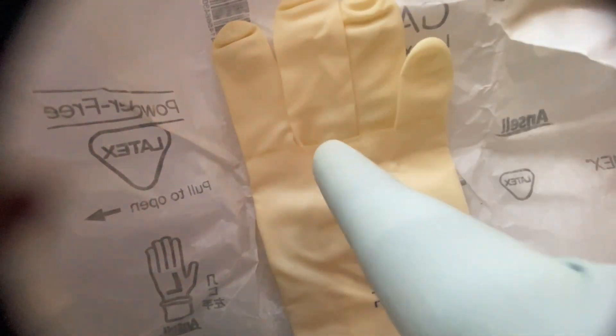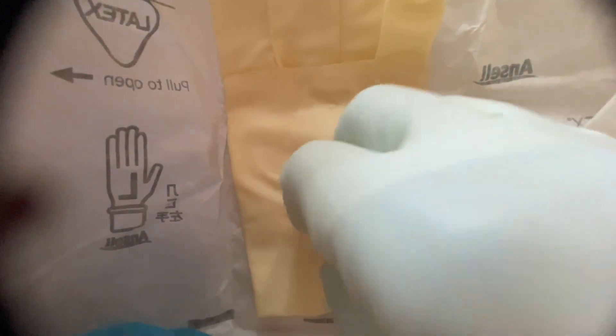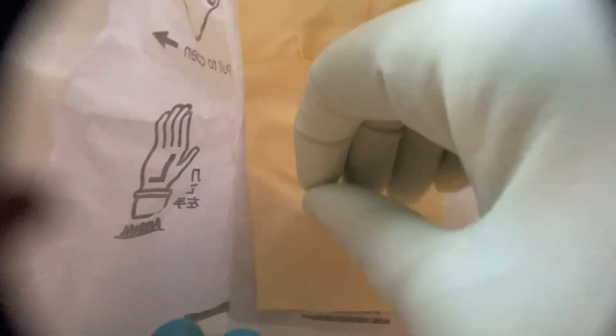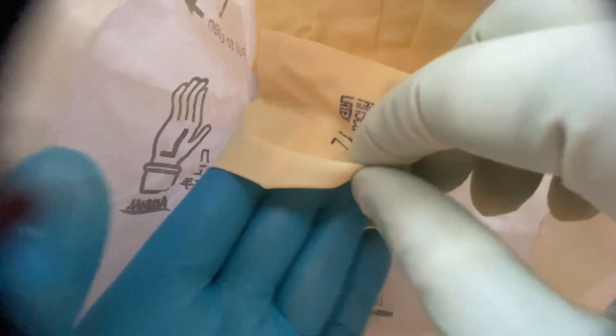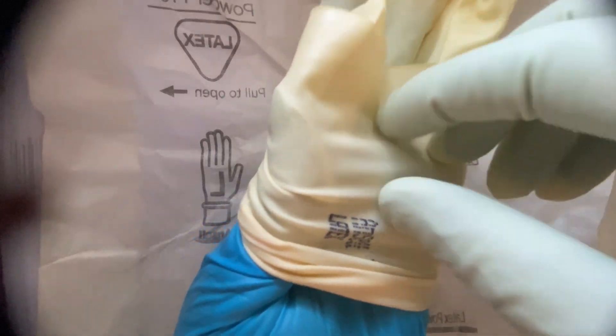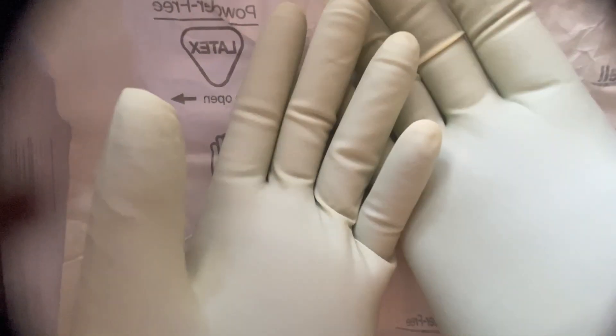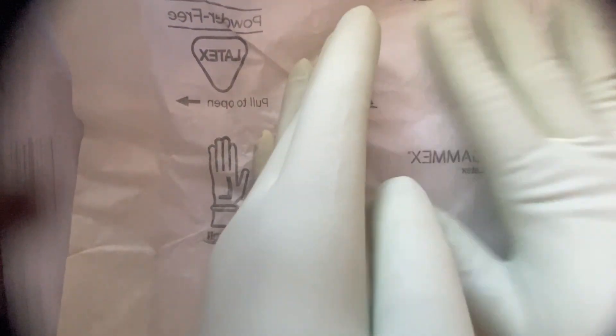Make sure you do not touch the sterile part. Hold the cuff and pull up. For the second glove, your already-gloved hand should not touch the non-sterile area — put your hand inside carefully. Make sure this glove hand also does not touch any non-sterile area. Pull up so the glove goes above the wrist. Now you can touch the sterile paper wrapper — that is your sterile field.